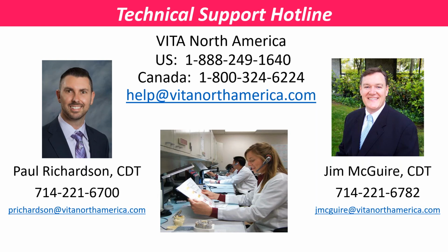Does the shading liquid work with all of the ZR VITA products? So the effect liquids I showed, the blue, the gray, the brown, and the chroma, are universal for all of our YZ, and actually you can use them on any zirconia because they are exactly that. They're just effect liquids. So you can use them universally.